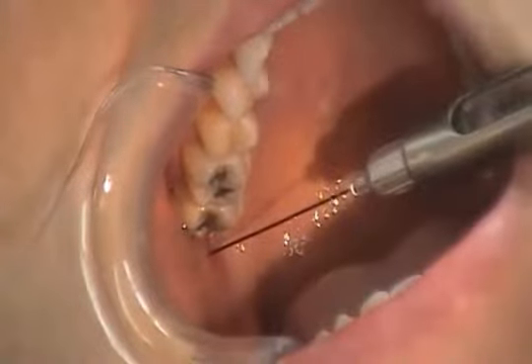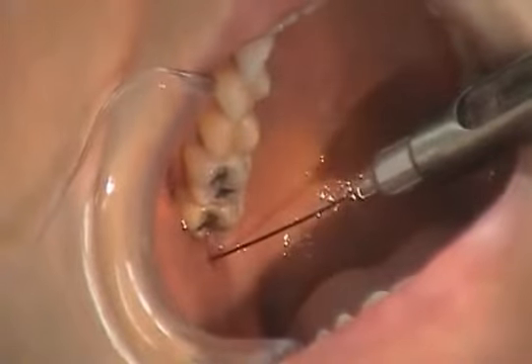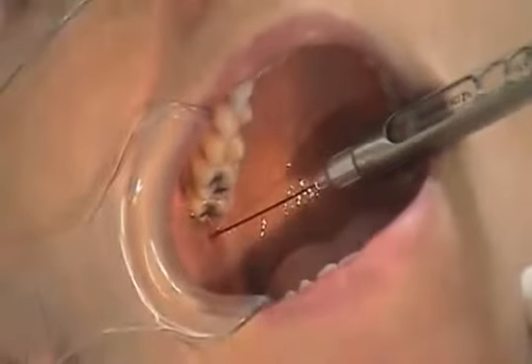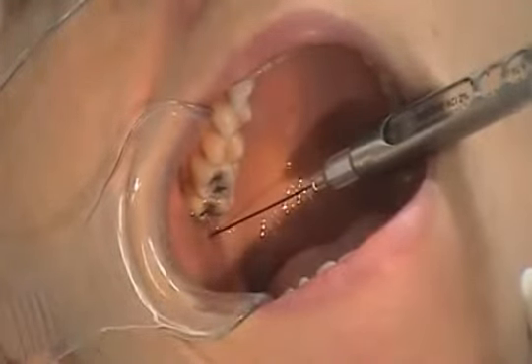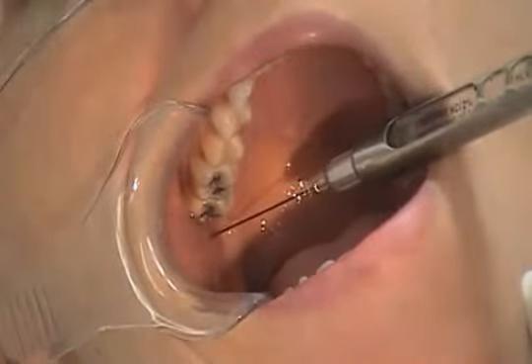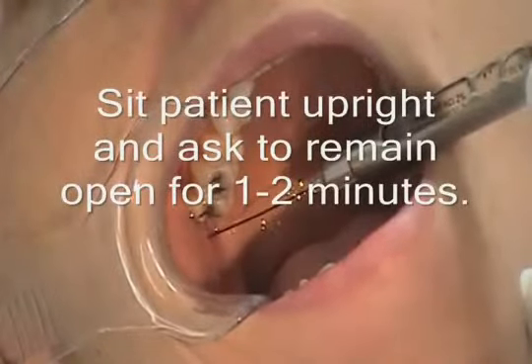Move the barrel of the syringe somewhat more distally, thereby angulating the needle tip anteriorly, and re-advance the needle until bony contact is made. At this point, you'll withdraw the needle approximately 1 millimeter, aspirate, and inject 1.8 milliliters over 60 to 90 seconds.